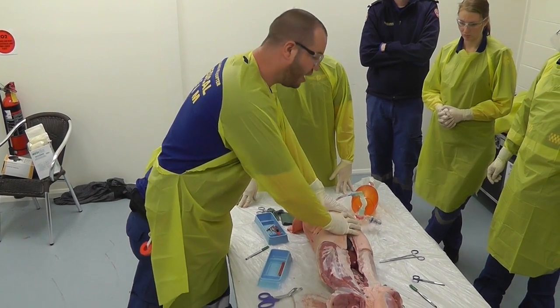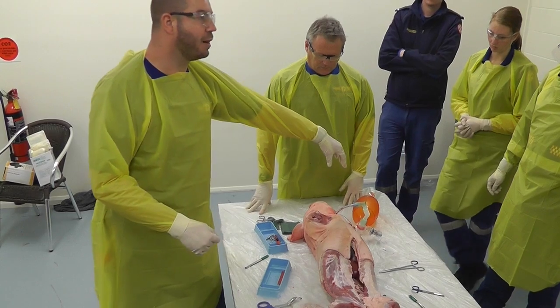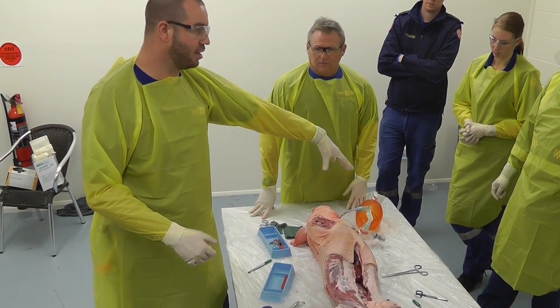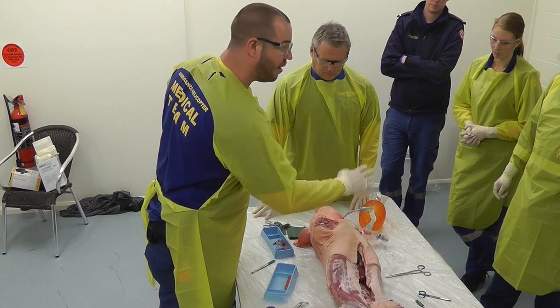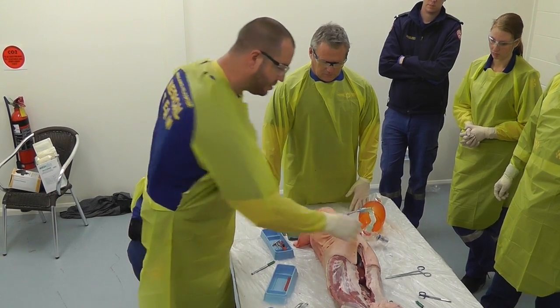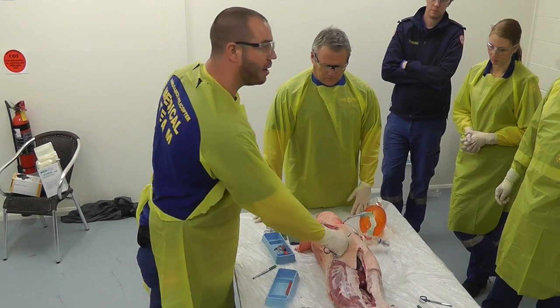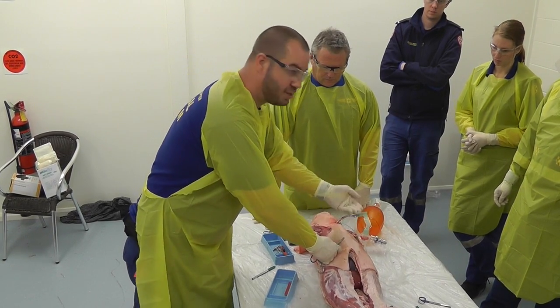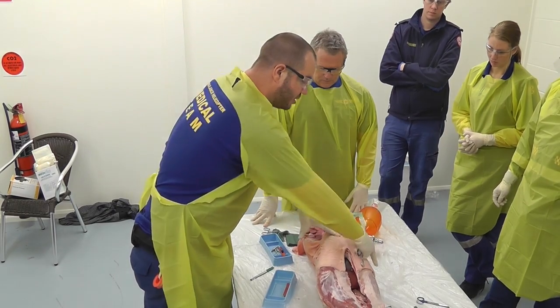The first thing you are going to see when you look inside is the heart and the lungs. If they are ventilating you are going to see straight away where the tubes and the trachea are, because the lungs are going to be coming out at you. There will be a pericardial fat pad and you are going to need to divide some of that — often blunt — so there is not any excessive bleeding afterwards if you get ROSC. Blunt or scissor that pericardial fat pad off the posterior aspect of the sternum.